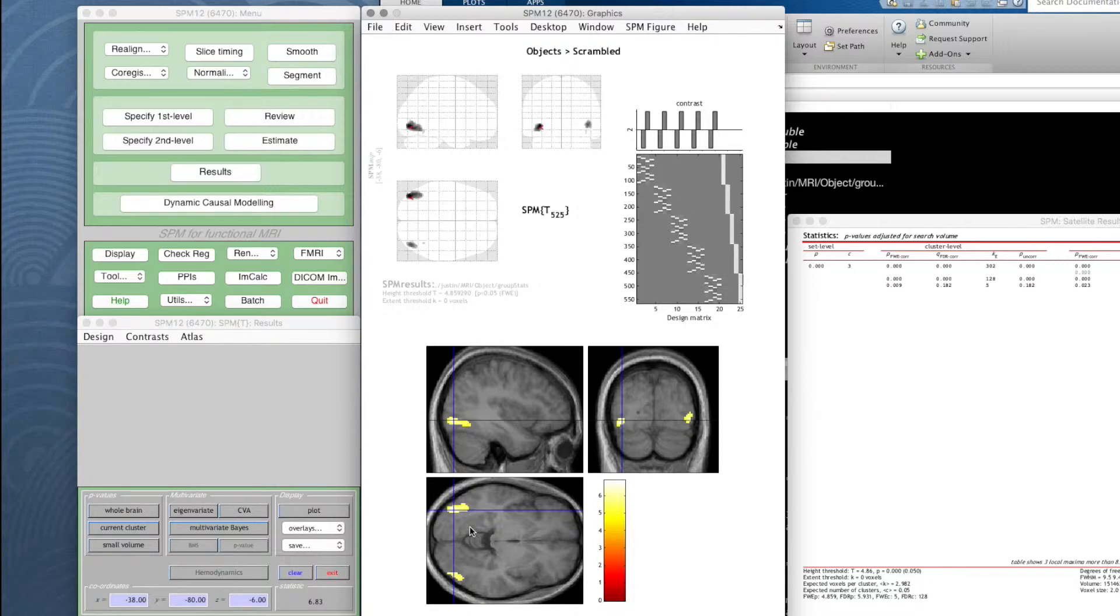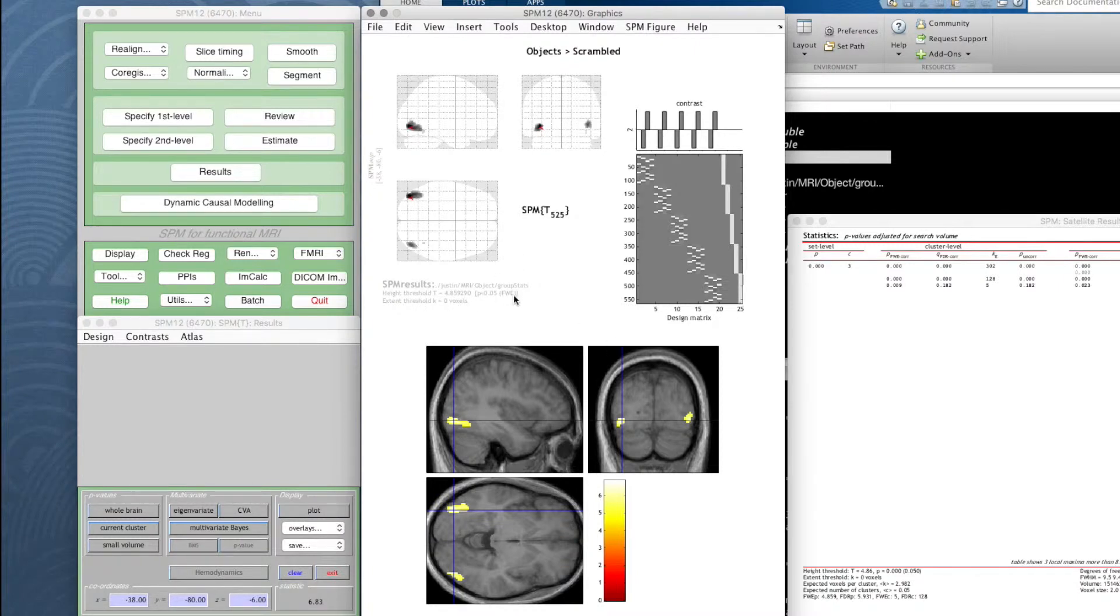We can do that but there's a small amount of work involved. This particular set of blobs, this view with this t-threshold defined by our corrected p-value and this extend threshold showing these blobs, we can save that as a 3D image.